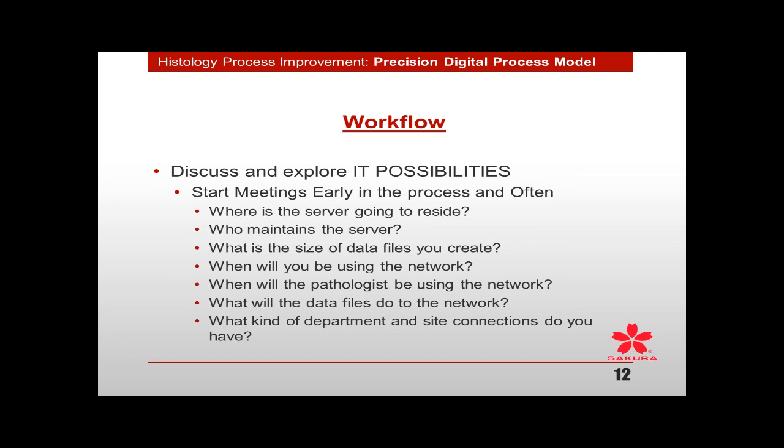This cost will be many more times than the cost of a scanner that goes into histology. The cost of IT for being able to integrate the software, use the network, and store all of your images is many, many, many more times than what you're talking about in that physical scanner that goes in. And then something I didn't even mention, software licenses. If you buy a scanner from a particular company and you don't buy the ongoing license, what's it going to cost you to get the upgrades to their software, to their capabilities?